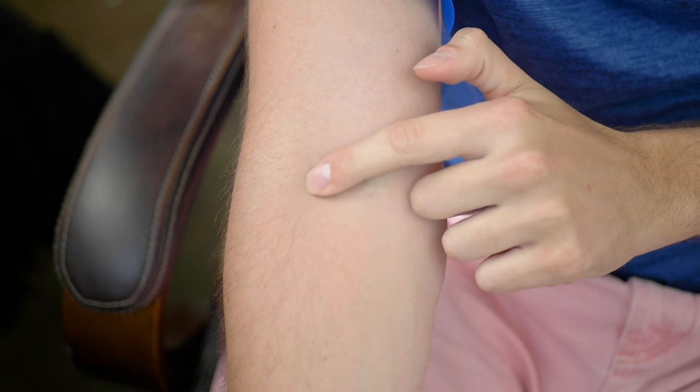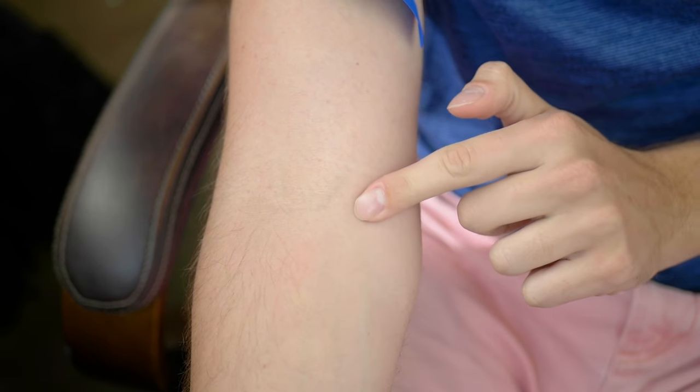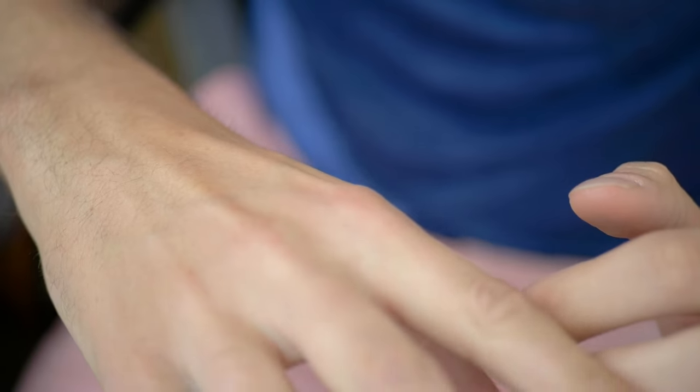Looking at the AC area, you can see there are actually four big areas — two in the middle and one on each side. I usually like to start by going by sight because it's the fastest way to find veins. You can see some more in the forearm, nice and straight, which is always a good thing. Looking onto the hand, you've got a couple more options with some veins that look fairly straight.